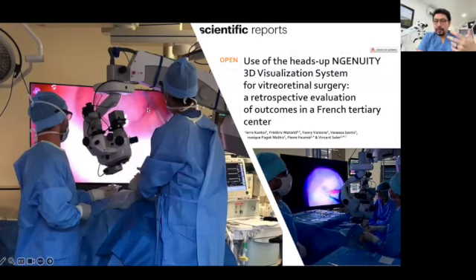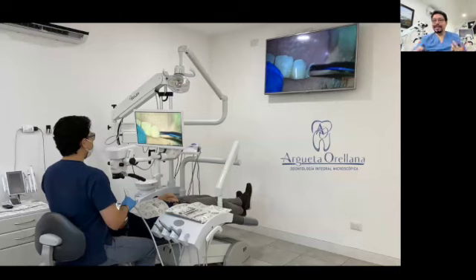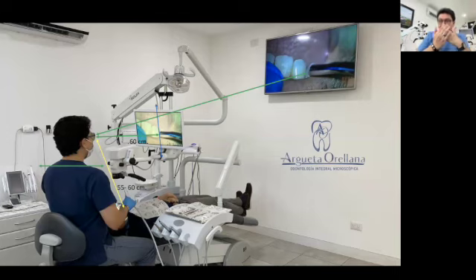So it's not a new technology. What is new is that Seiler managed to bring this technology into dentistry, which is a big accomplishment. So let's analyze the distances. This is how we work here in the office. You see that the screen is just in front of me. The proper distance for having the best quality of 3D images and for being relaxed during the full procedure is 60 centimeters. And the distance between your eyes and the mouth of the patient is around 55 to 60 centimeters as well. If you go farther than that distance, it won't provide you high quality 3D images.